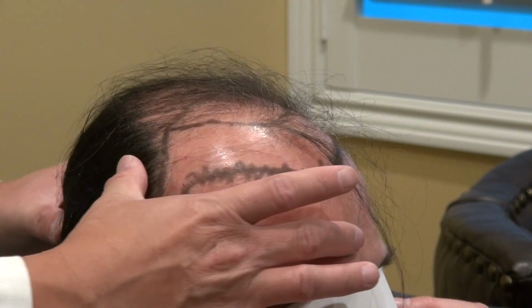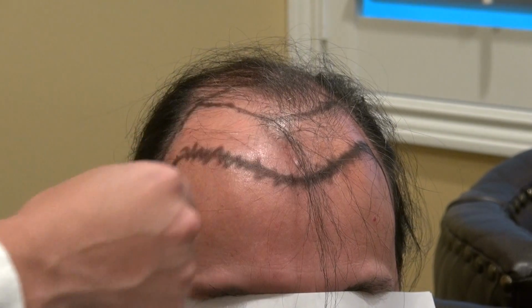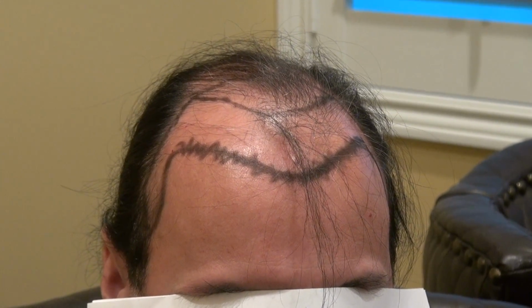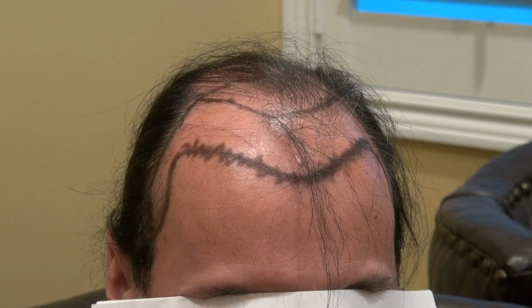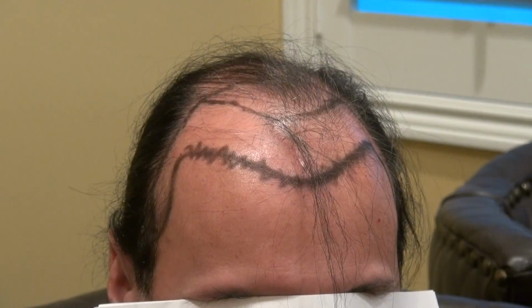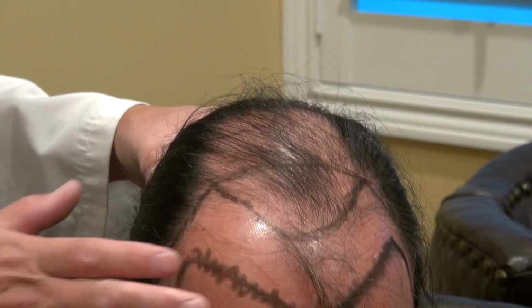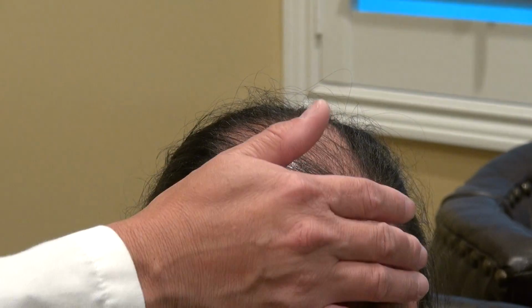If you look straight across from me, okay. Once we get the shape down, no hairline is straight, so we zigzag through it. And then the precise angle, as I mentioned already, and the selection of hair grafts. We try to plant rows and rows of single hair grafts in the front, followed by the 2 hair, 3 hair, and 4 hair in the back for bulk and volume. And if you can look down for me a little bit, you can see how thin he is from front all the way toward the back. And we're going to fill from the front all the way toward the back using 4,500 grafts.